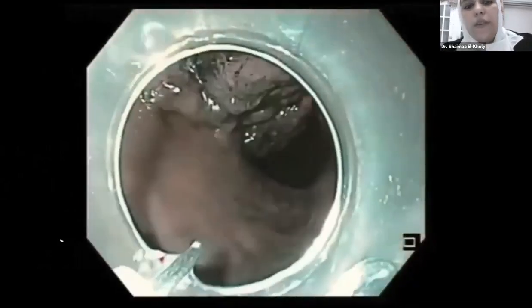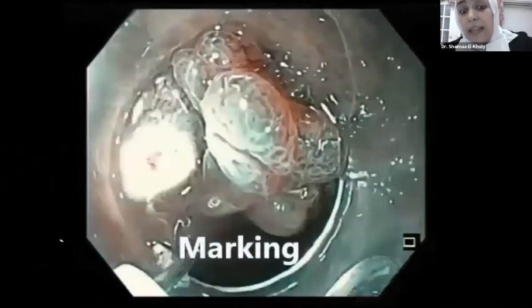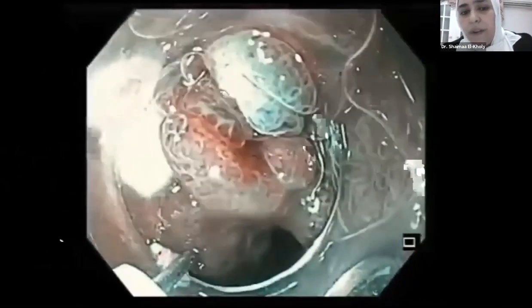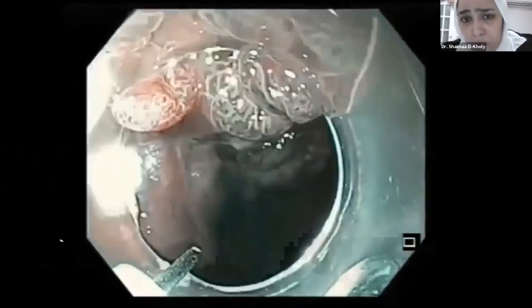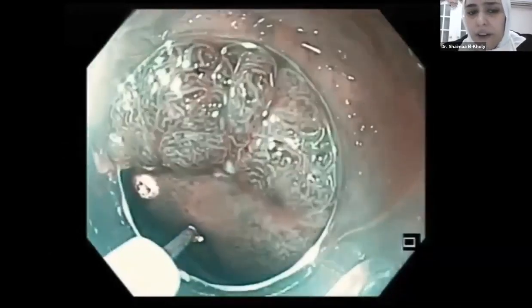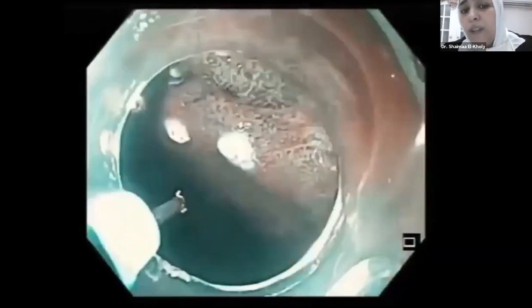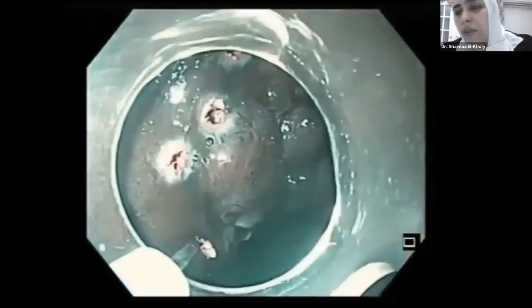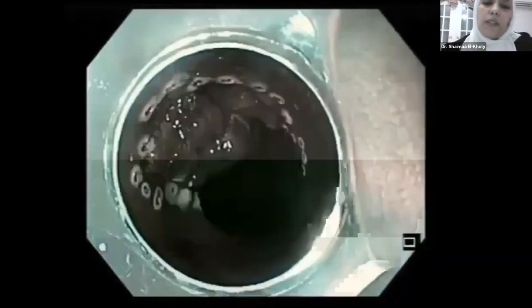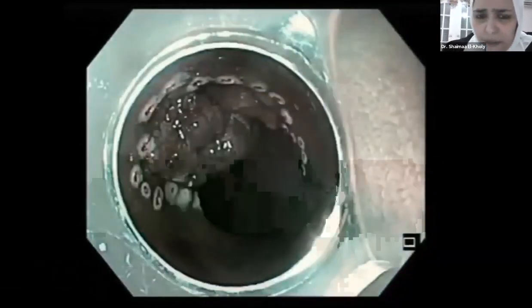We will start with marking the lesion. It's very important to mark the lesion here with the narrow band, as part of the lesion was not obvious before the NBI mode. And it's very important that you clean your field very clearly and you inspect every part with narrow band or chromoendoscopy, just to guess if there is a suspicious invasion or not. As we finish our marking, we see that the lesion is big. It's occupying about 70 or 75% of the circumference.